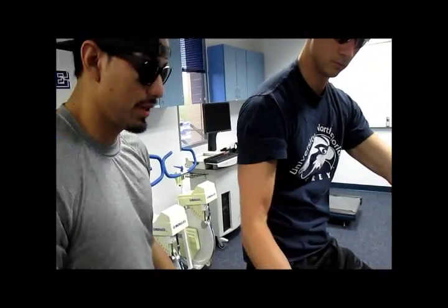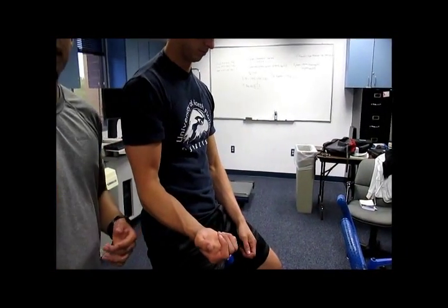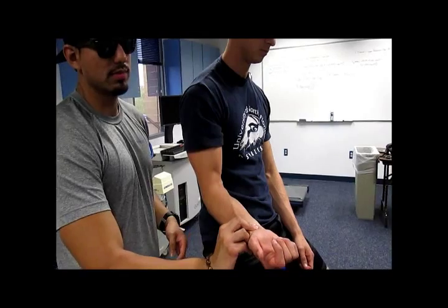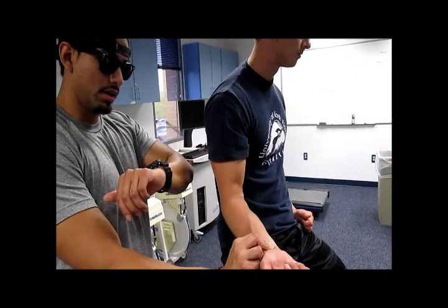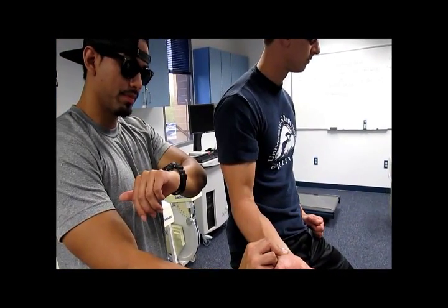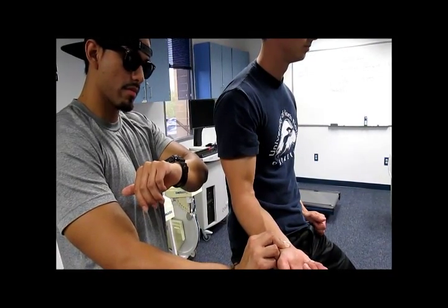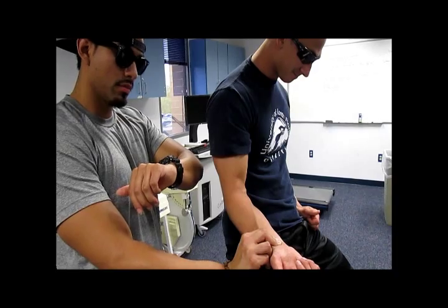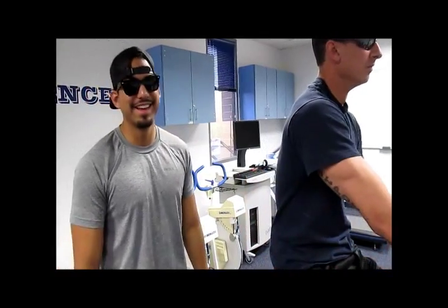Now take that off. For heart rate, you're going to use your two fingers and place them on his radial artery. Find that pulse, and once you get it going, count for 15 seconds every beat you feel. I got 14 — take that number, times it by 4, and that will get you your heart rate.